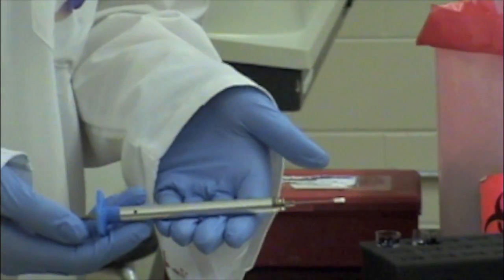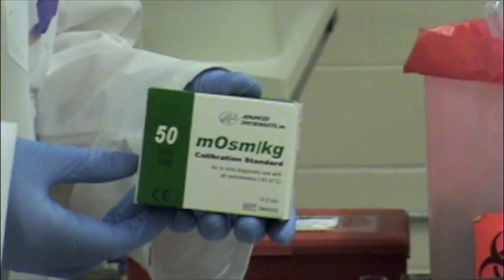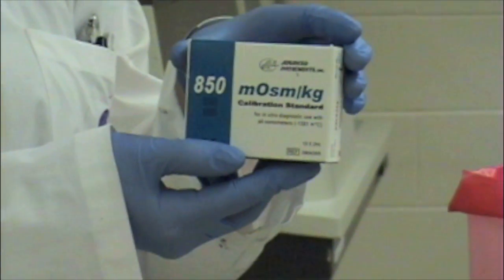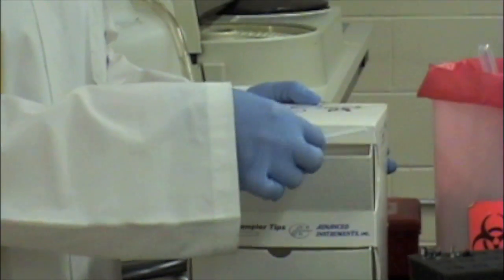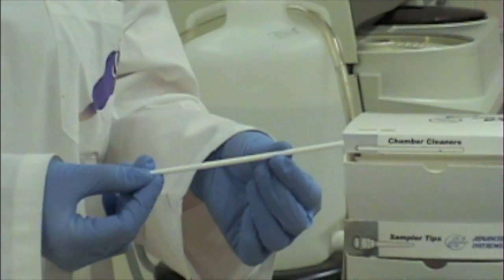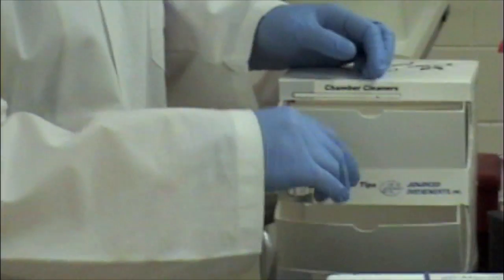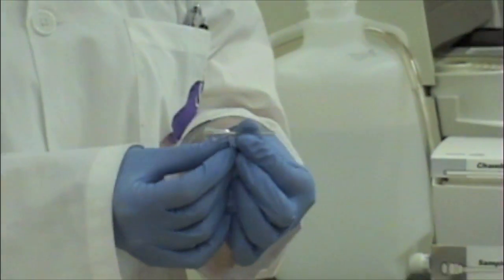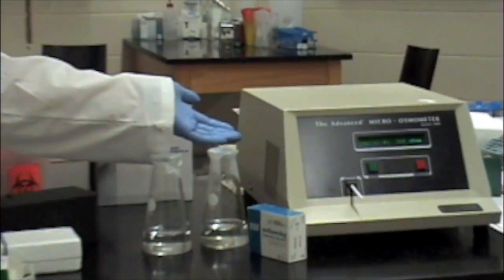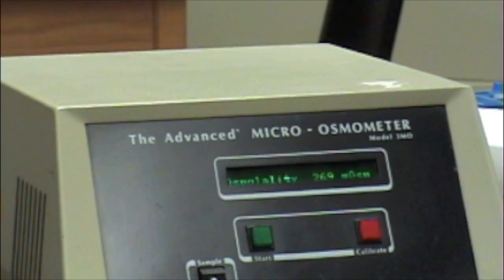a 50 milliosmol per kilogram calibrator, as well as an 850 milliosmol per kilogram calibrator, chamber cleaners, and sampler tips. The analyzer that is used is the fully automatic advanced microosmometer, model 3MO.